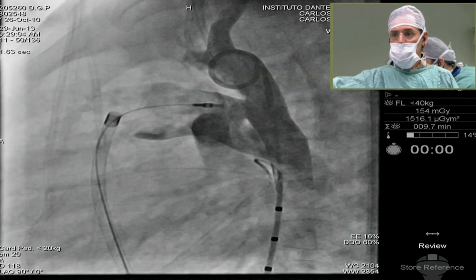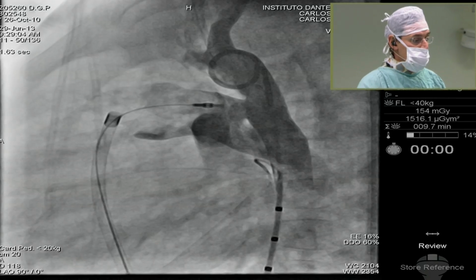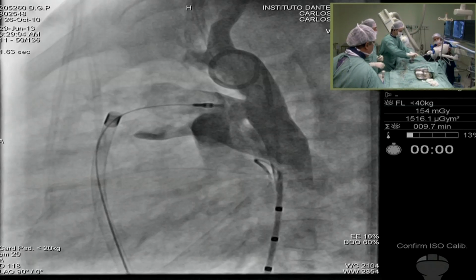Okay, whilst you're doing that, I would suggest that he would try to use an 8.6 device. If he uses even a 10.8 device, the disc is still going to be 16. Yeah, so an 8.6 device will be my choice here.